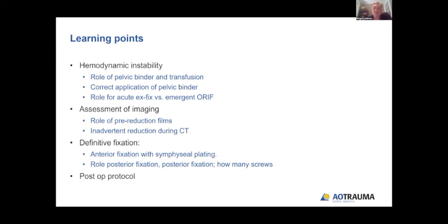Another thing that could be considered is, if this patient was a different scenario and went to the OR for, say, a laparotomy, if the situation is right, it's quite reasonable to go ahead with symphyseal plating if that's something you're comfortable with and the patient is in a reasonable situation. Certainly, for me, I can put an anterior plate on in about the same amount of time as an external fixator, and it will be good for him long term.